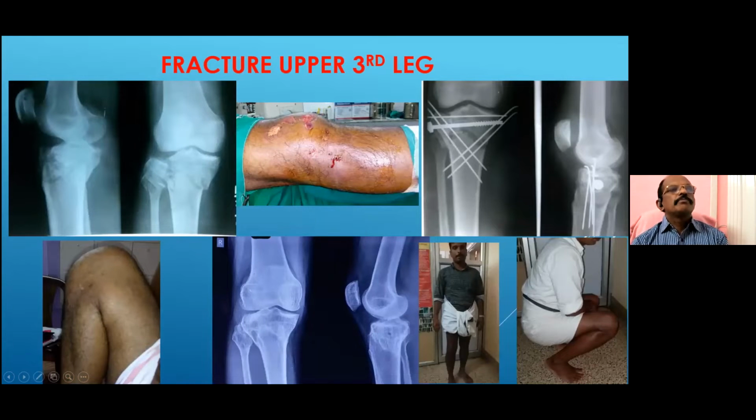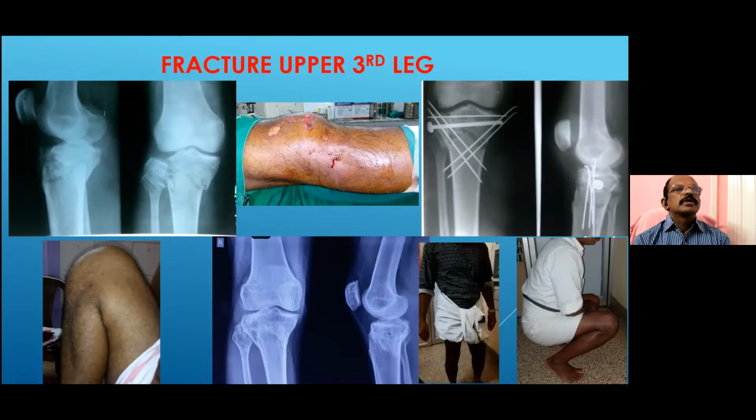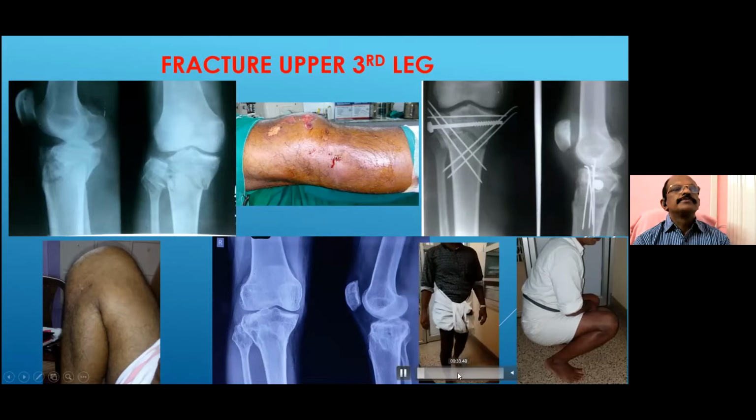This is a fracture of the upper third leg. The patient came after 3 days from another hospital, where the local condition for doing the surgery was not suitable at that time, and they advised him to return to the hospital after 2 weeks. But that patient had severe pain and severe edema, so I admitted him. And on the second day, I did closed reduction and percutaneous pinning, as well as a cannulated cancellous screw for the transverse fracture. You can see the outcome of that surgery.